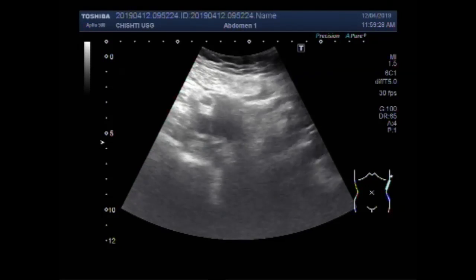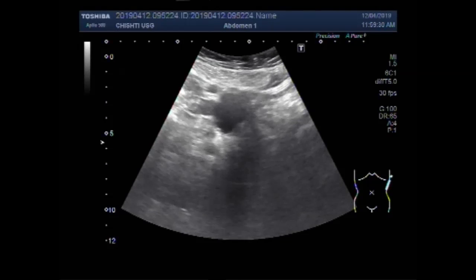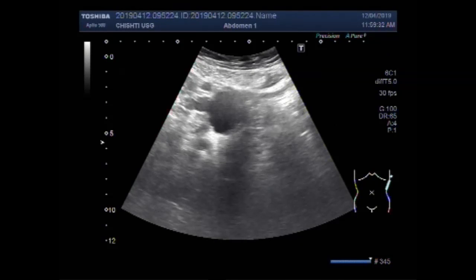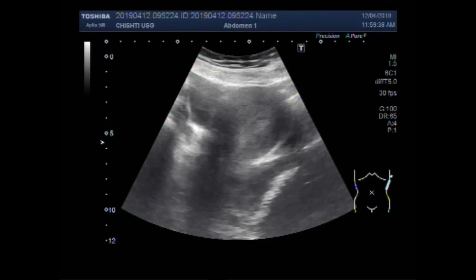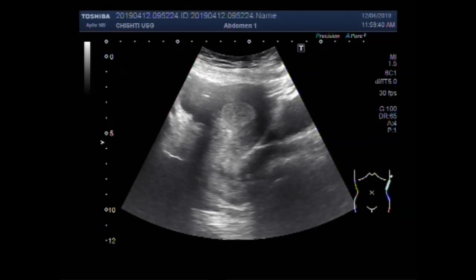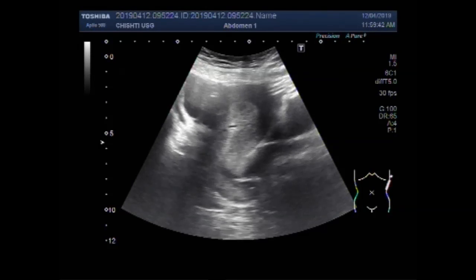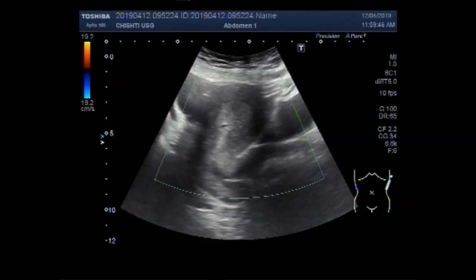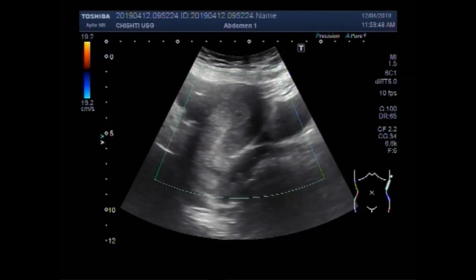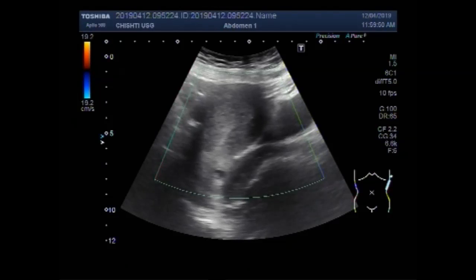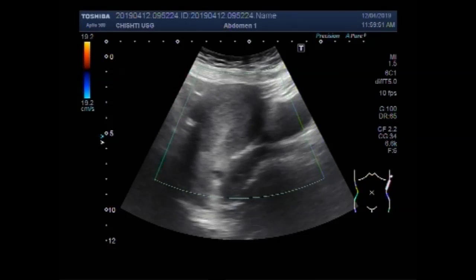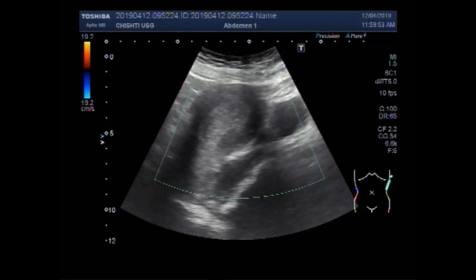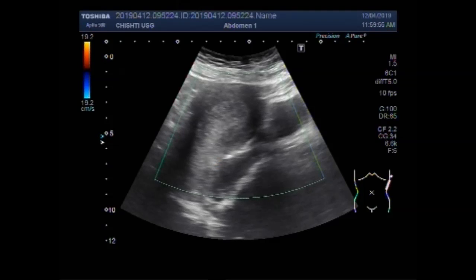You can also see a left ovarian cyst — this is the left ovarian cyst. Again you can see the polyp, and there is no significant blood flow seen in the polyp.